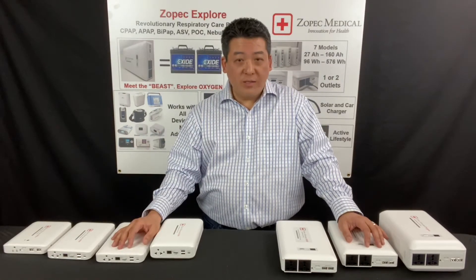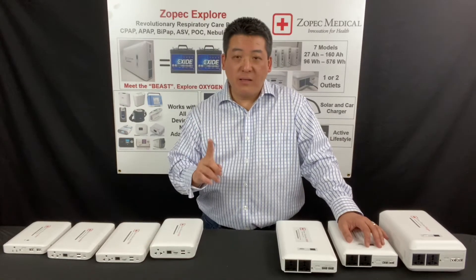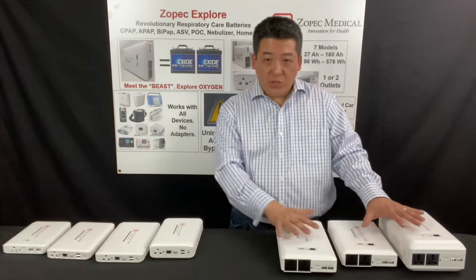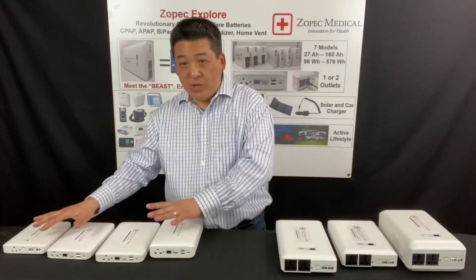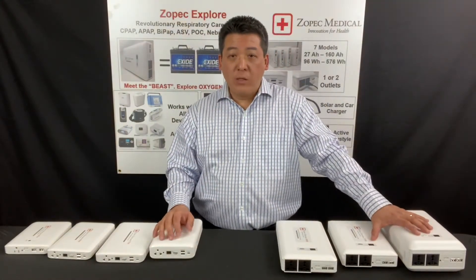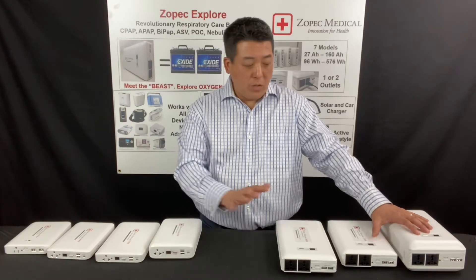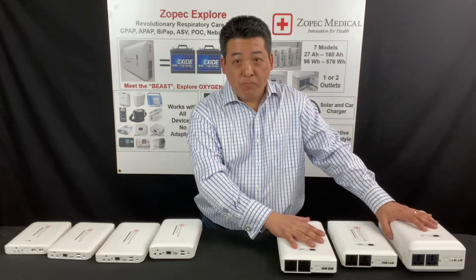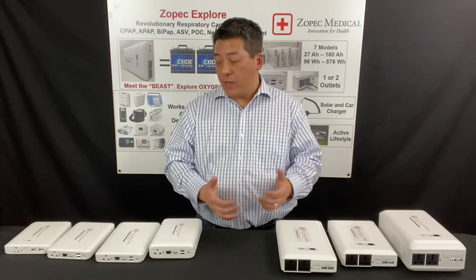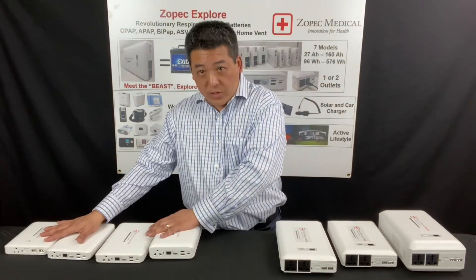So how to select the right battery? We have seven models, but it's very simple — we have two series. We have the professional series and the portable series. If you are mostly concerned about power outage and you want to have uninterrupted sleep at home, you will go with the professional series. If you're not so concerned about power outage at home and use it primarily for travel, you will use the portable series.